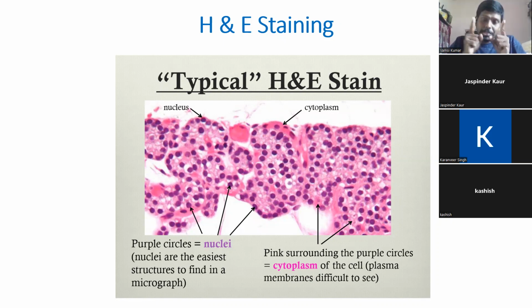That means I still want a tissue section, but without damaging the antigens. I still want the section, but without protein destruction. Okay, somehow I did some magic and I preserved the proteins. The antigens are preserved. Now, how can I locate them? How can I track them? How can I identify the proteins, the antigens present in this tissue?